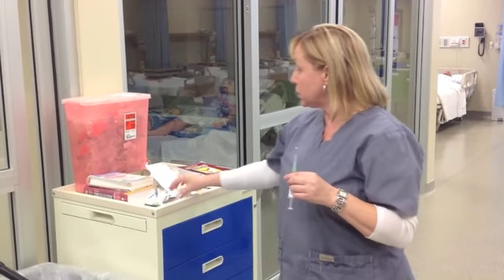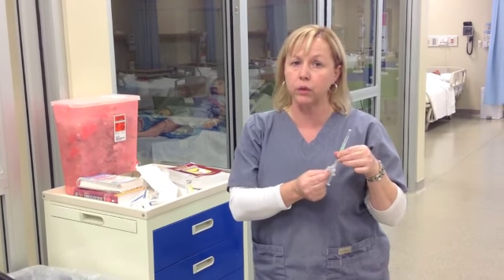So now we're going to go into the patient's room. I'm going to need an alcohol pad and my medication with a label on it. Make sure you label this before you leave the med room. So we're going to come into the room.